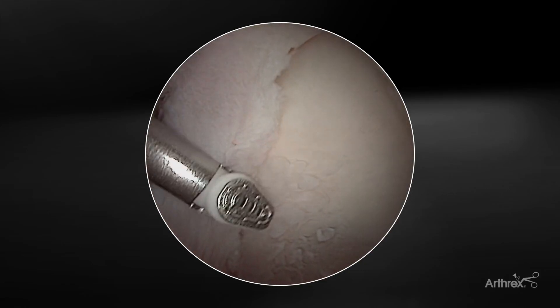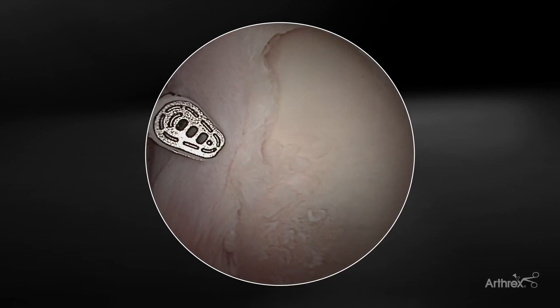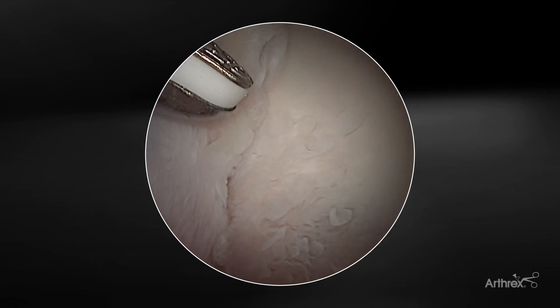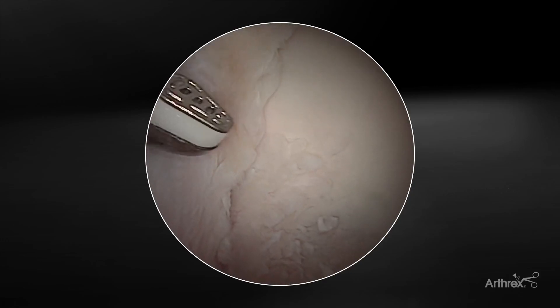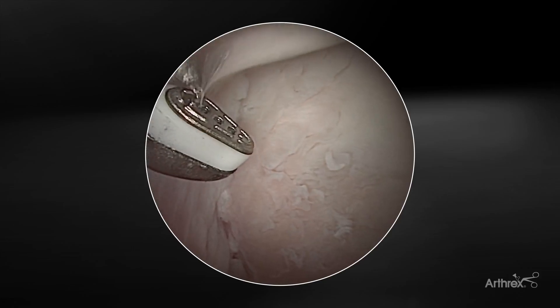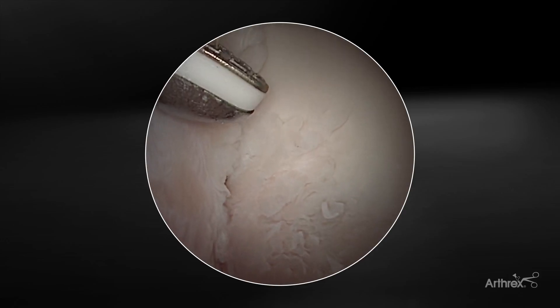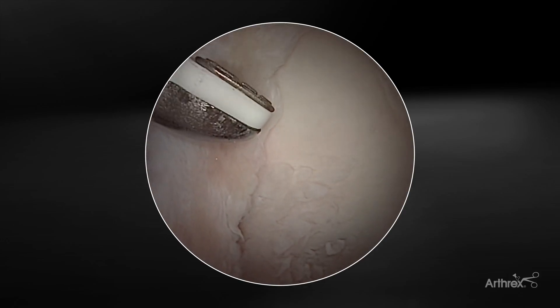Introducing the i90 into the joint, you can see the labrum here — some degeneration, a degenerative labral tear. To debride that, as I activate the device, you can see the plasma formation over the face and on the sides of the device. The plasma is really well-contained with the i90. And because of that well-contained plasma, you've got something called edge control, where if you just put the edge of the device against the target tissue, you get really focused, targeted treatment of that degenerative tissue.